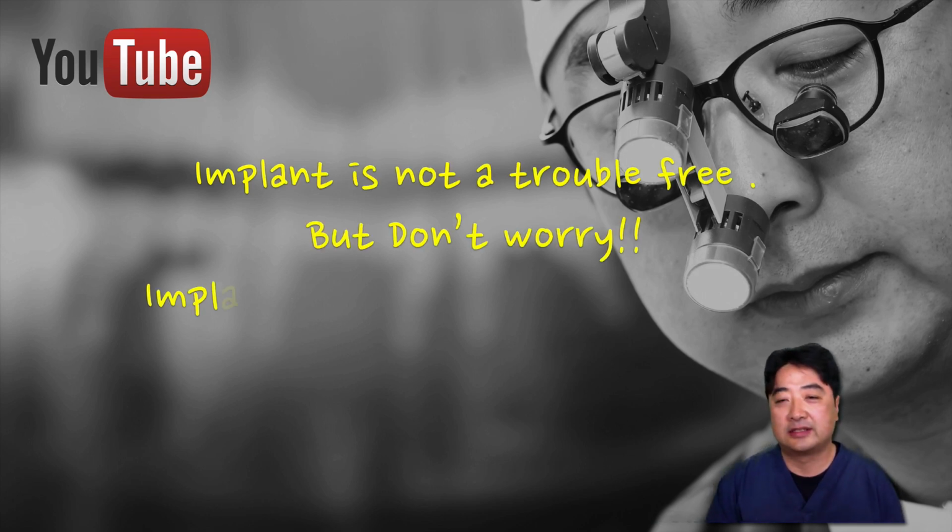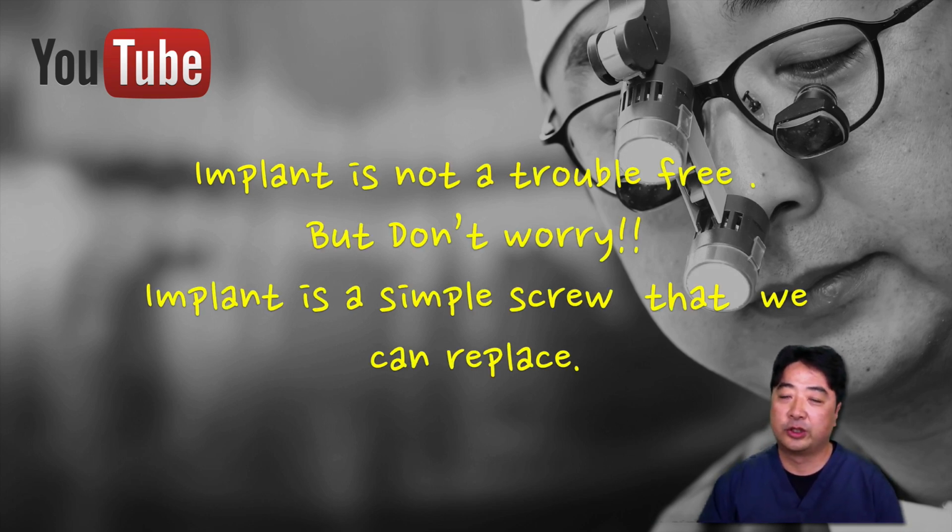We know implants are not trouble-free. So implant location from the beginning is very important, but that's what we already know. But don't worry, an implant is a simple screw that we can replace. Better not, but we can do it.